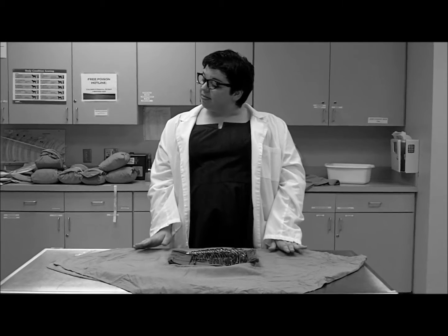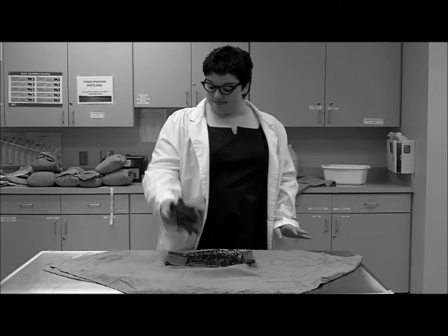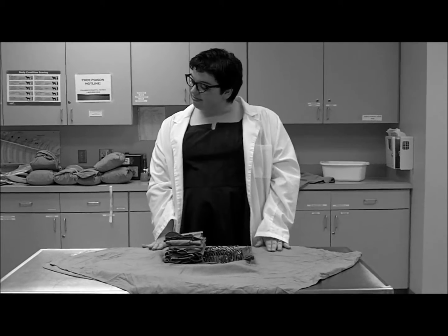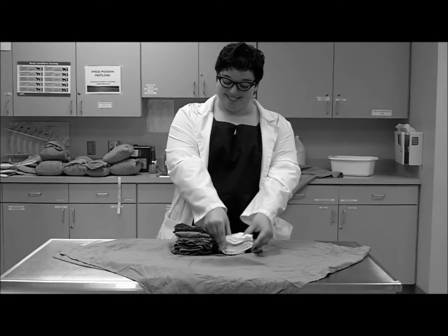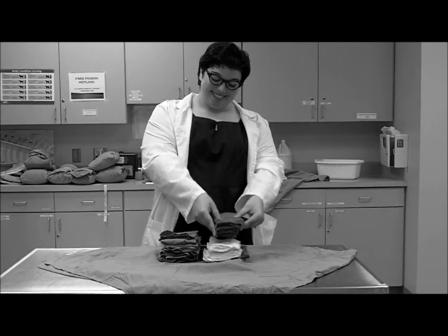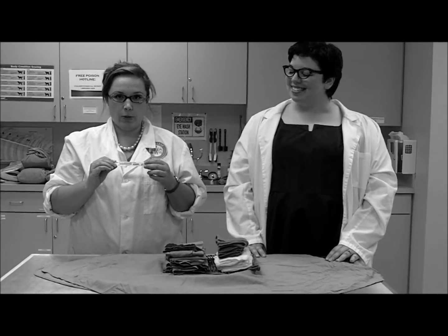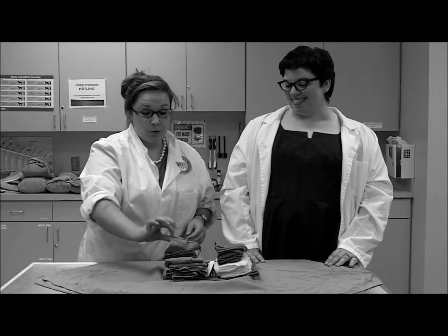Well, Emily, each major surgery pack requires one small and one large drape, followed by a healthy stack of gauze and one folded towel. It's important to remember to include the indicator strip in the center of the pack. And don't forget to fold your corner.